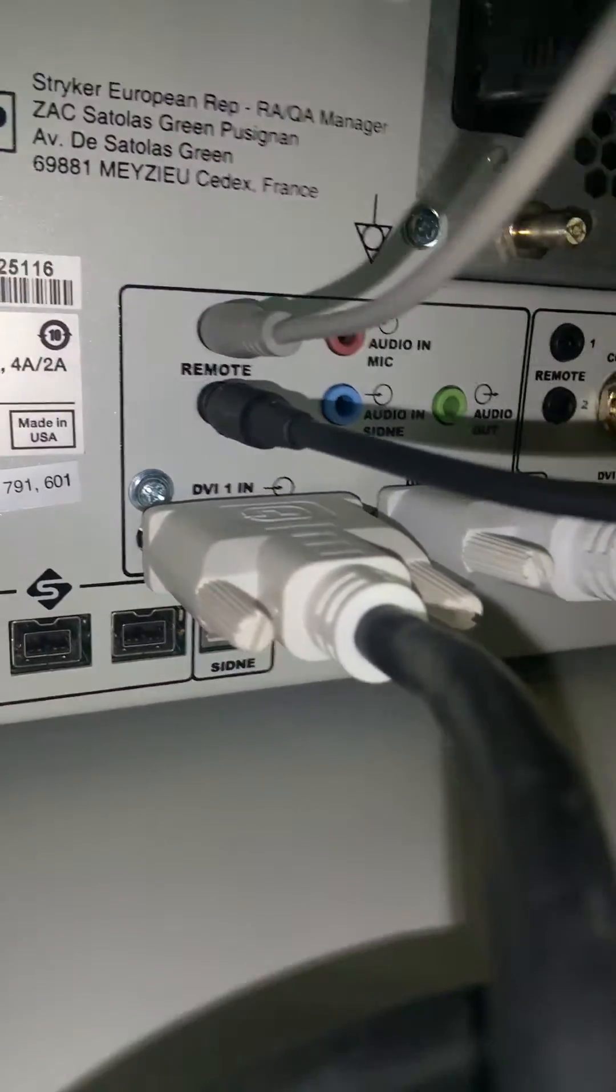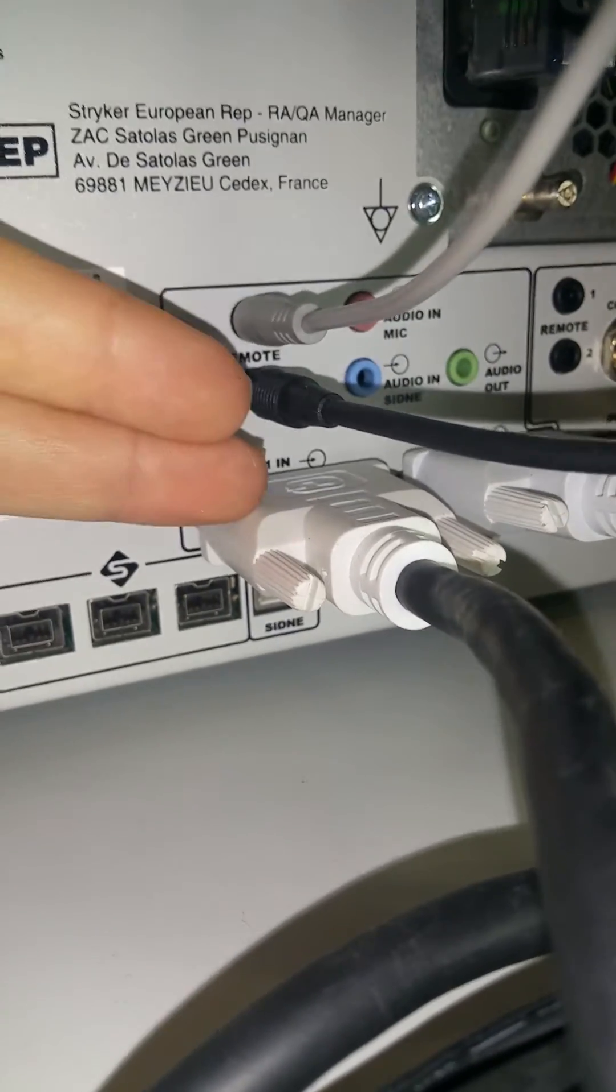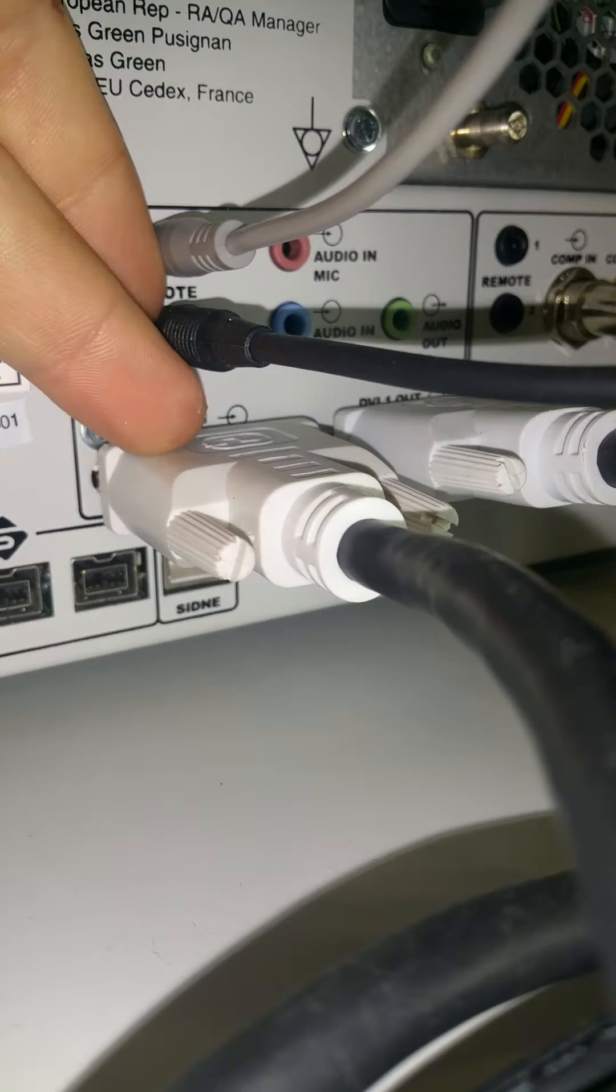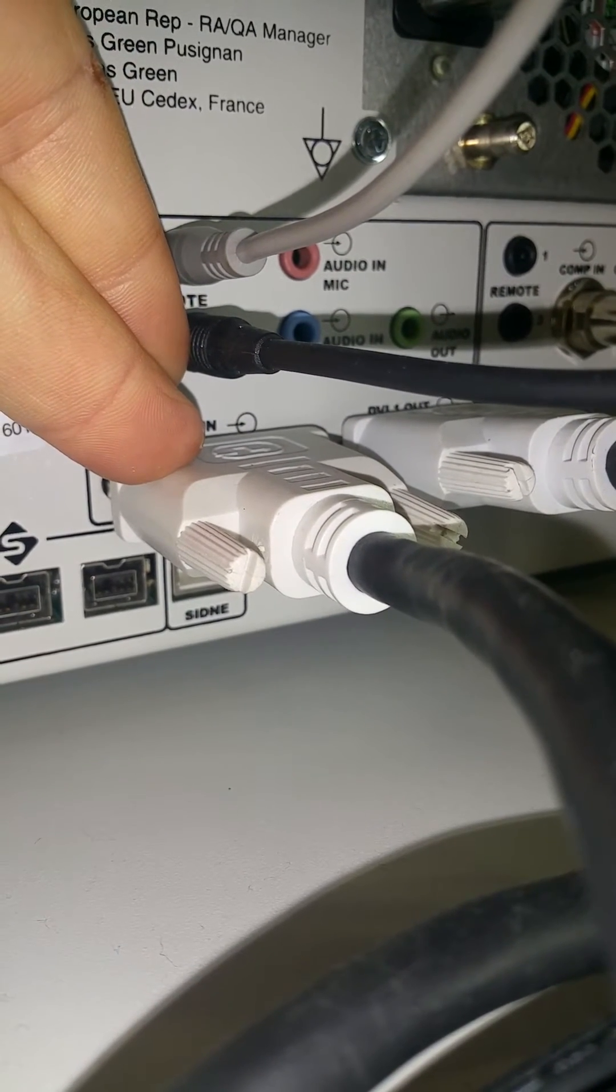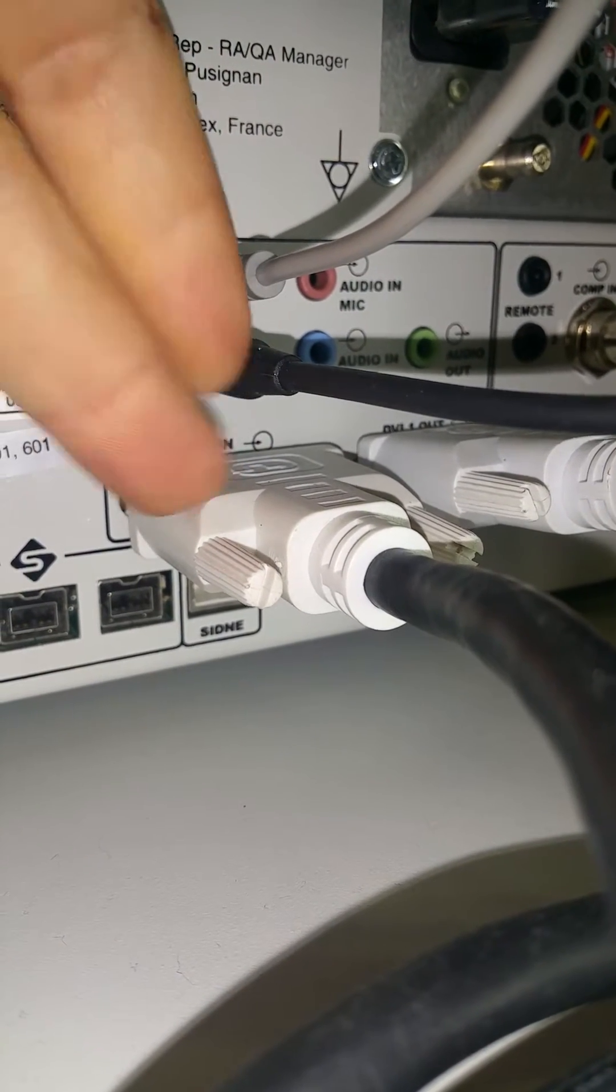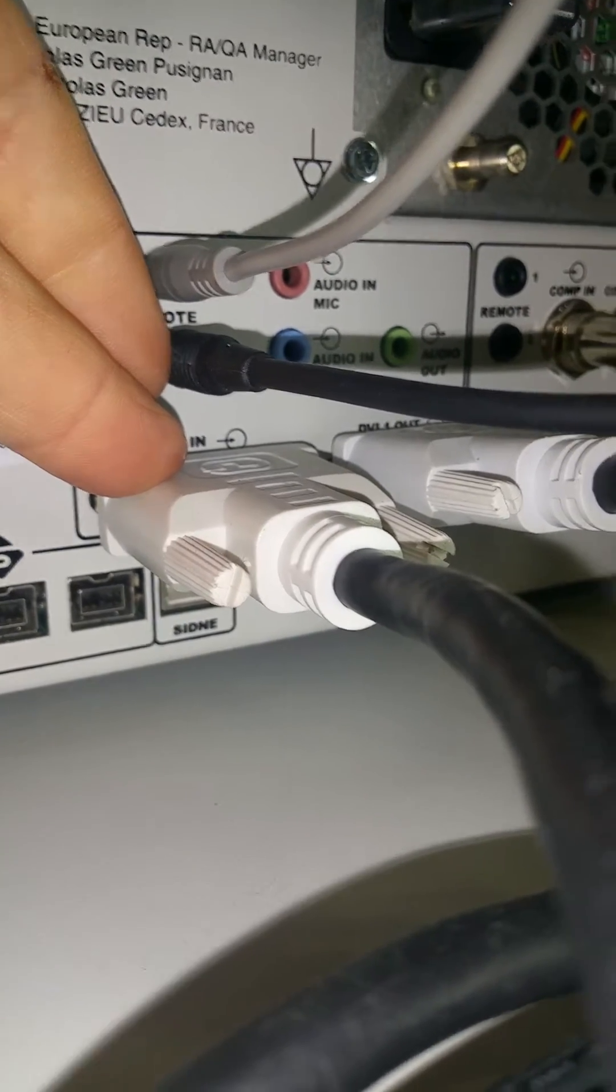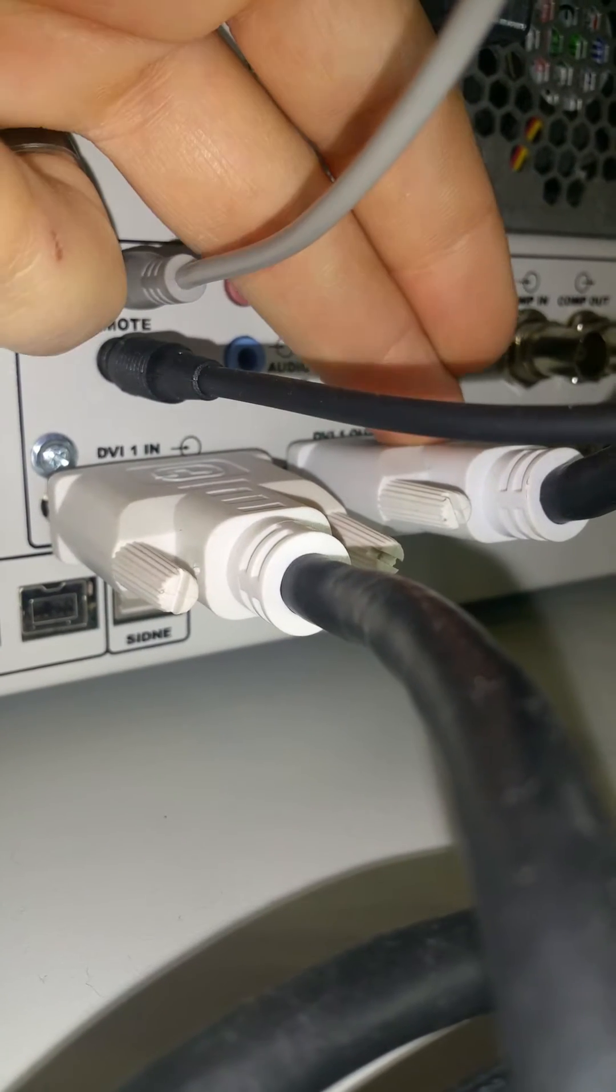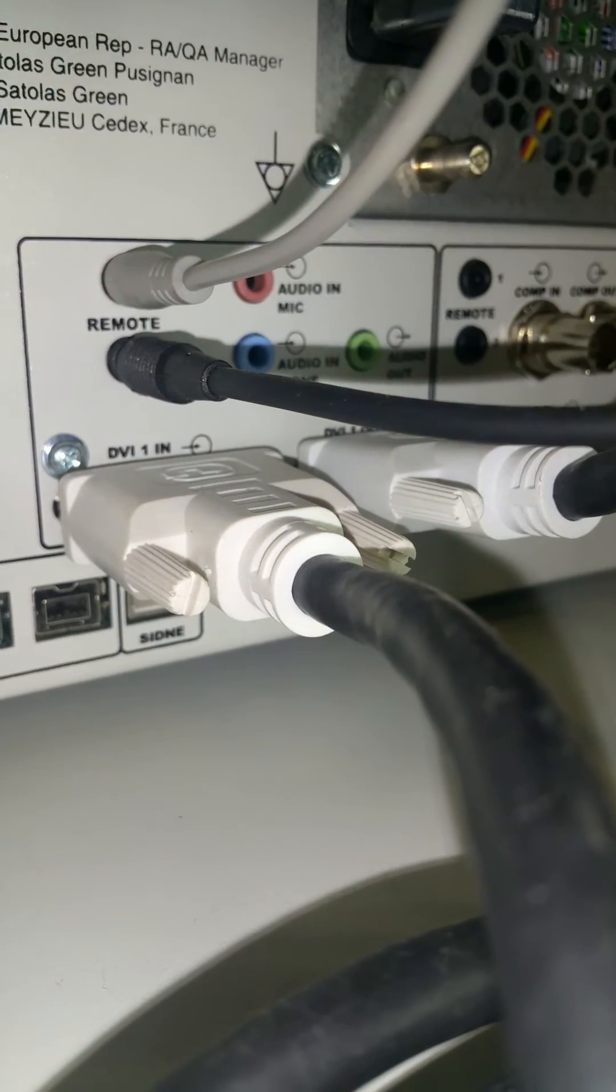And then you'll have your DVI cable. This is the DVI in and this is the DVI out. So this is the cable that is coming from your camera box. So your camera box output, the DVI cable comes right here to the input on the channel one of the SDC. And then the DVI out is going to be the cable that goes to the back of your monitor on the top of your tower.